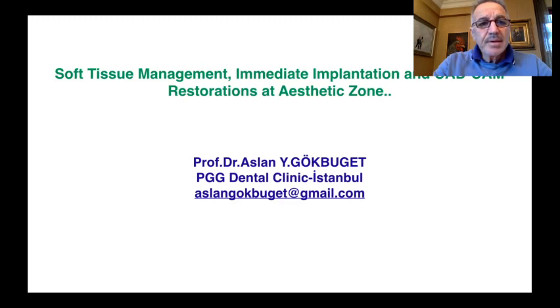So you're going to see soft tissue management, immediate implantation, and CAD/CAM restoration at the aesthetic zone. As you know, immediate implantation at the aesthetic zone has always been a challenge for implant dentistry. So this presentation is going to discuss a lot of different issues in the aesthetic zone.